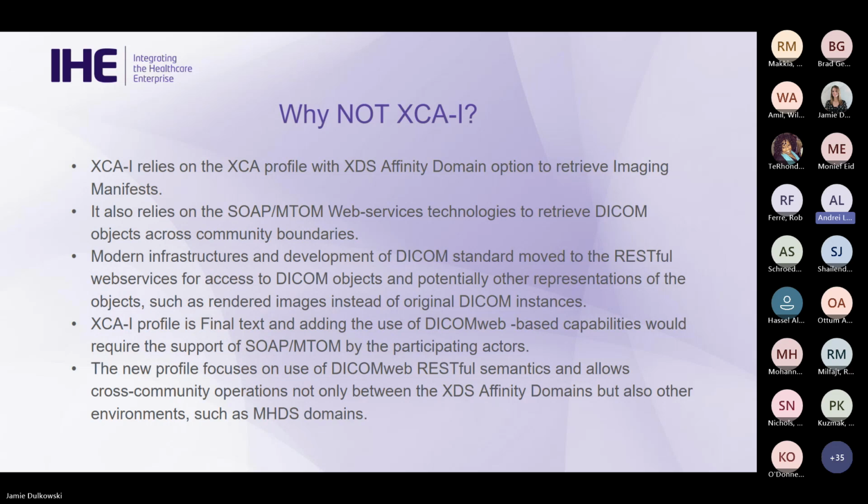And there are real life implementations of that profile. So what's the difference? There are a few things which distinguish the XC-WADO from the XCAI profile definitions and requirements.